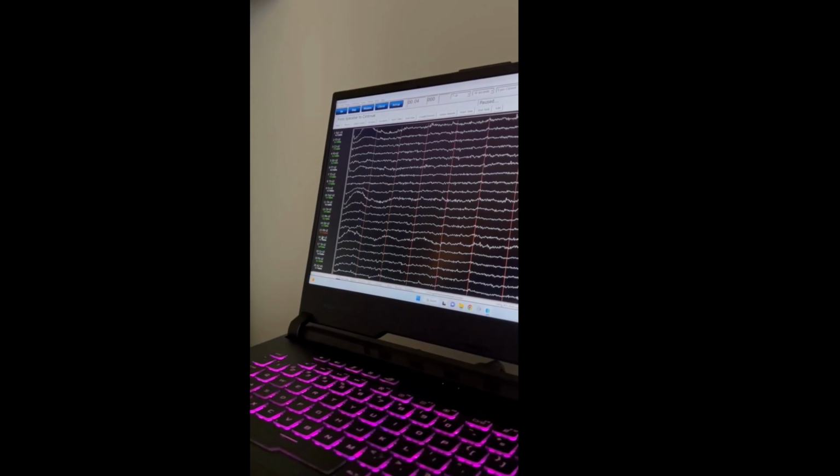The yellow, which we don't see on here, you would like to get the yellow down to under 10, so you have all green. And the red, you want to resolve. You don't want to have any red for your impedances. So what we're going to do is identify the area where the signal is being impeded. So we look and we see it is at F8.